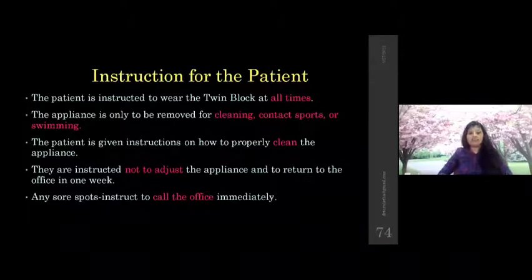Once he wears the appliance for 24 hours, that is at all times, only then are changes going to be visible. This has to be made very clear to the patient so that we can expect maximum compliance from him.